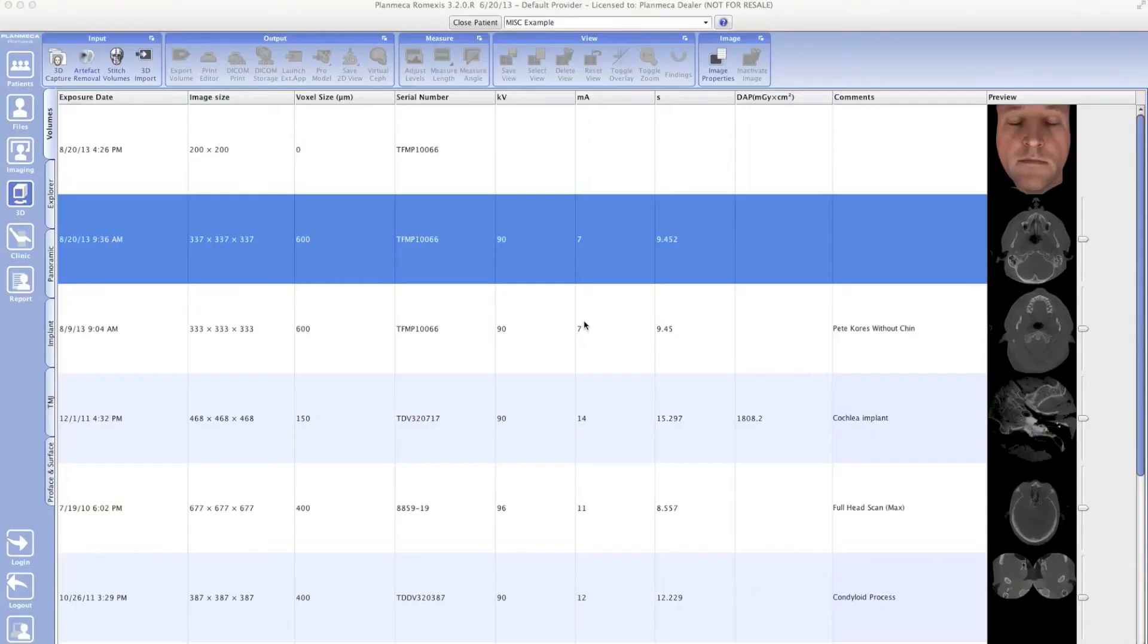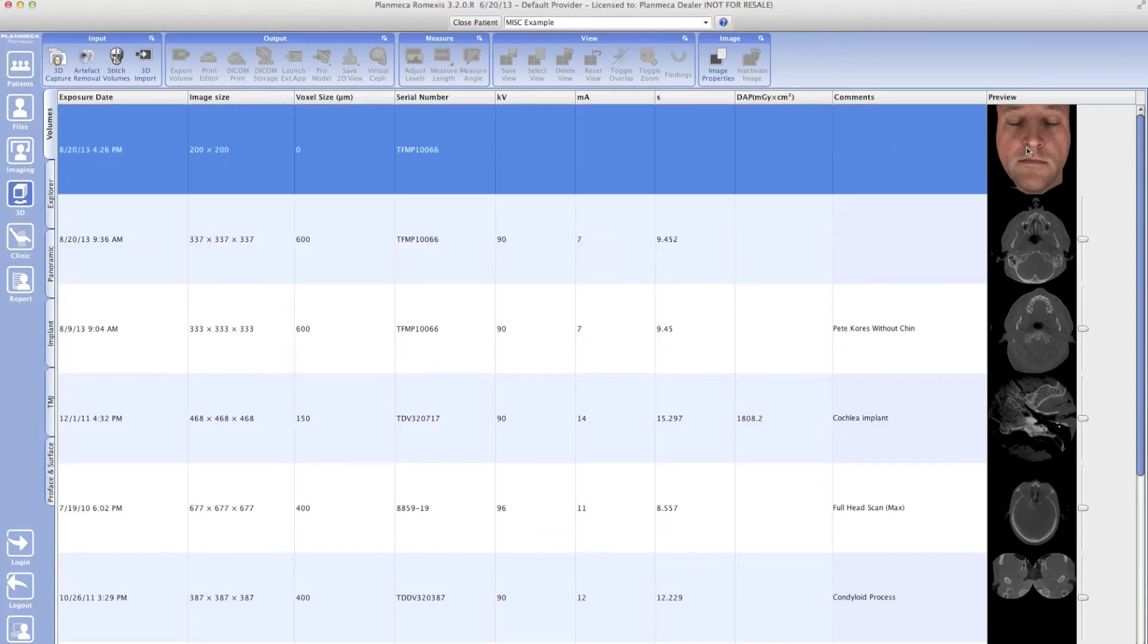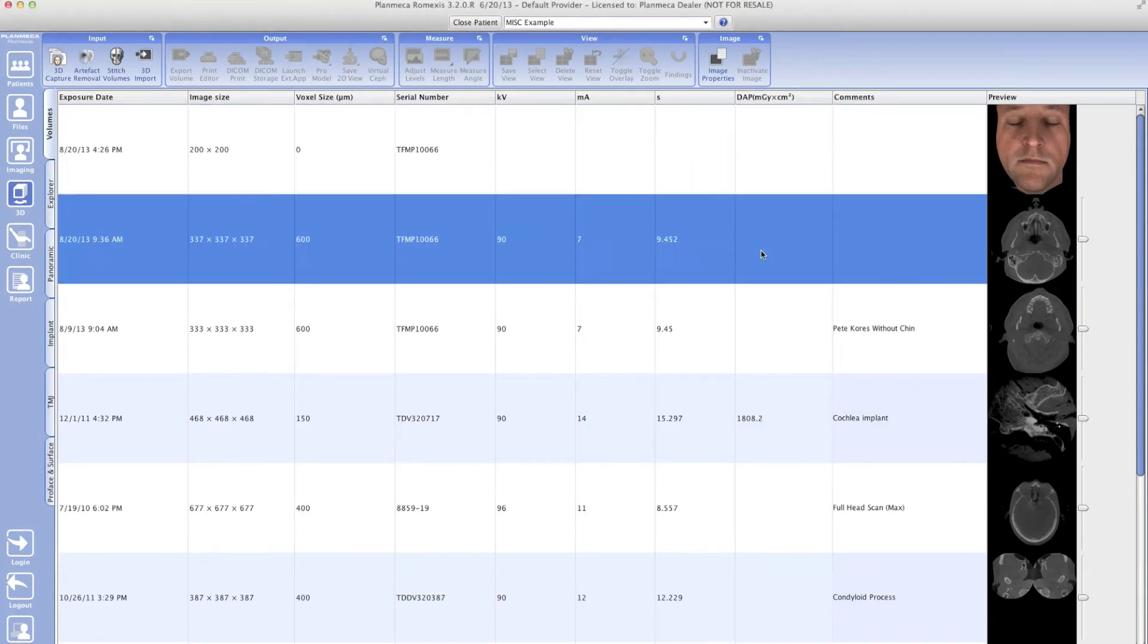So here we go. I have Romexis open and I already have my prophase image and my 3D volume. The prophase image is right here. I'm going to go ahead and double click my 3D volume and open that up.